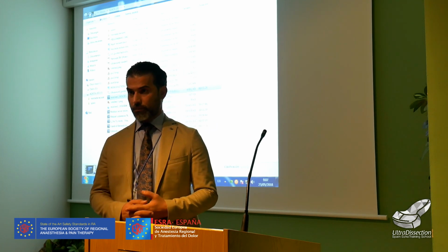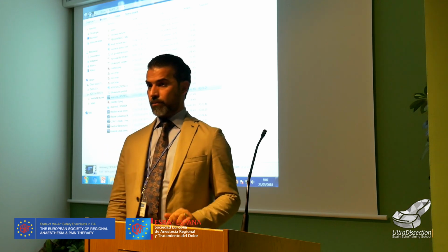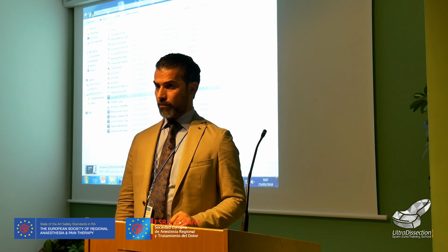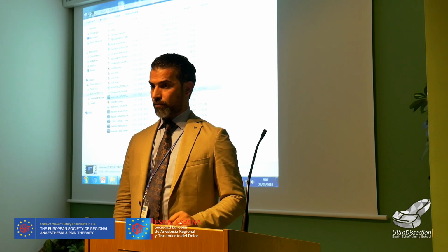Just for medico-legal purposes, you have a record of how you see the nerve, and I usually take one picture after the pulse radio frequency. You don't do it before because you change the lesion size when you use the contrast first. So it's an addition, but very important for this reason.